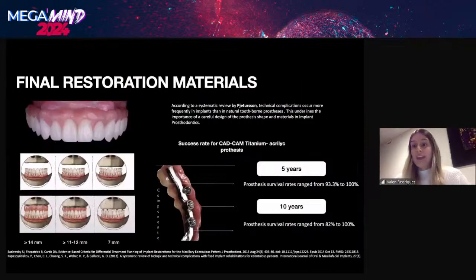So now, until the healing process is happening, we start to plan how we're going to do our final restoration. Okay, so we start carefully researching all the options that we have for this final restoration. For this case, we start planning.